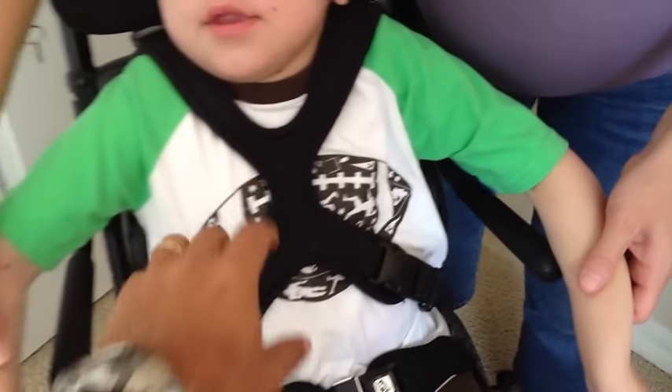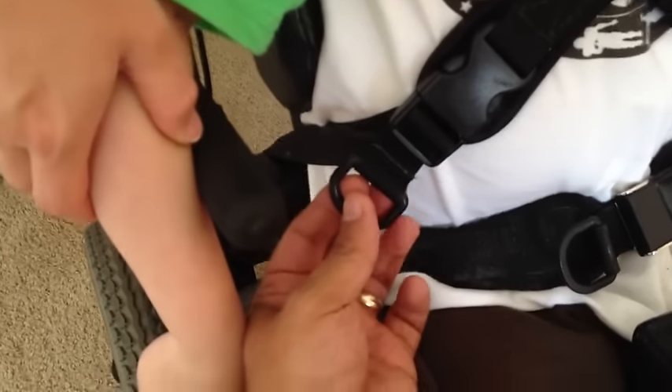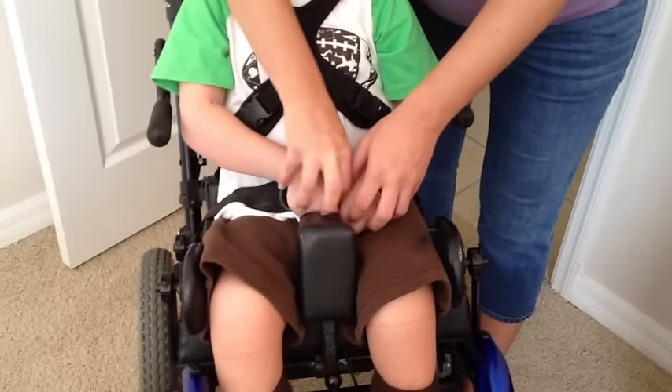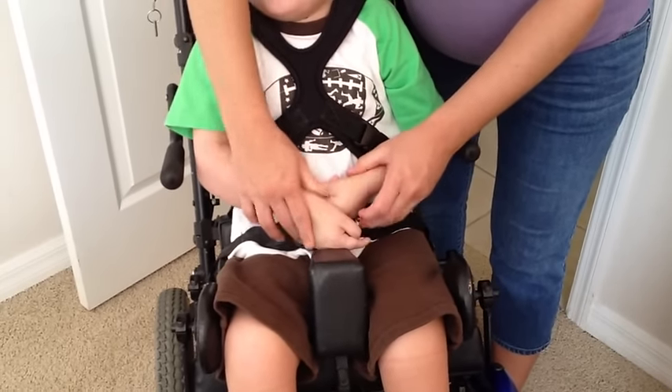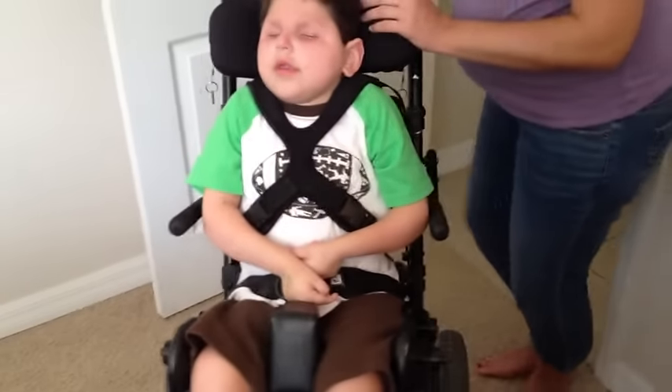Make sure it's not choking him under his neck. The strap should be down the middle of his chest, and if you need to make any adjustments, here's the piece right here — you can pull on that to tighten it and that will lower it down a little bit on this end. Then you're going to pull his arms and kind of criss-cross them at the bottom, get his hands situated, and he is ready to be rolled out to the garage for the school bus.